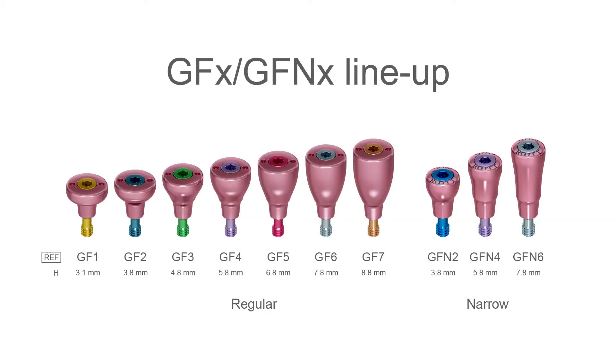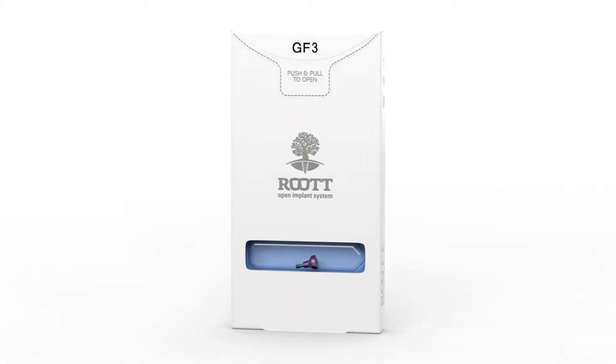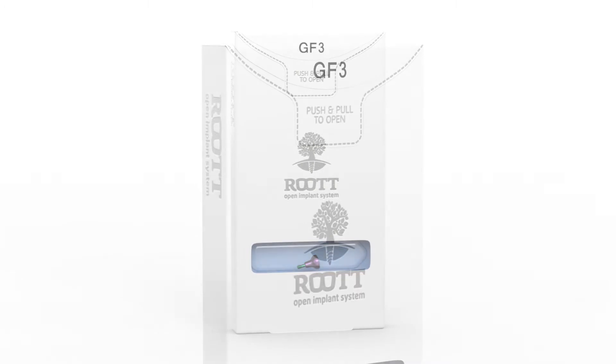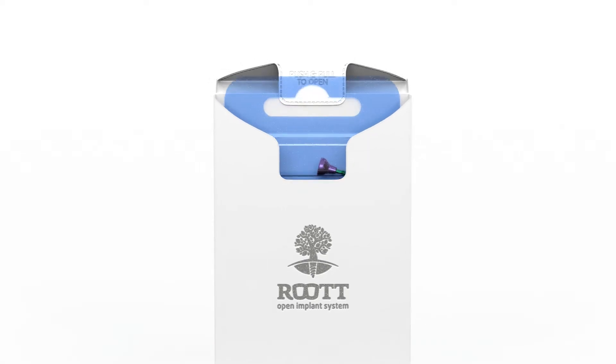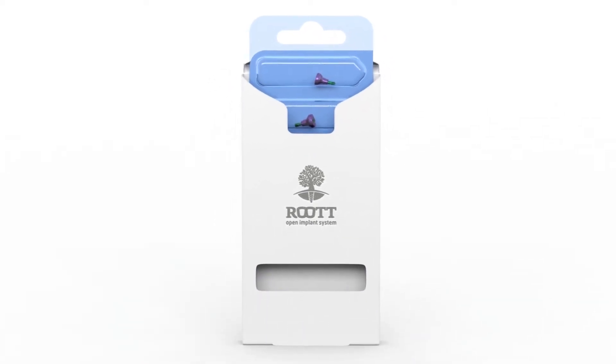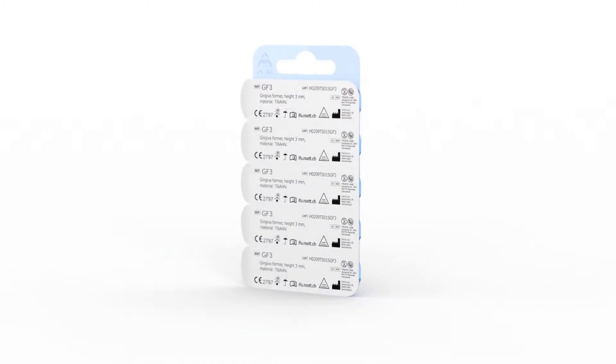There are a variety of healing abutments. Open the box and open the blister. Sterilize products before use.